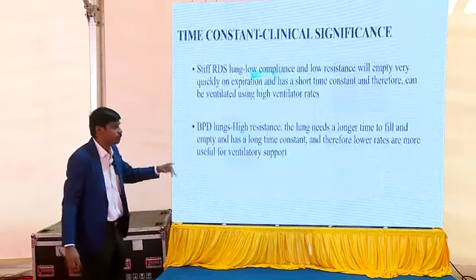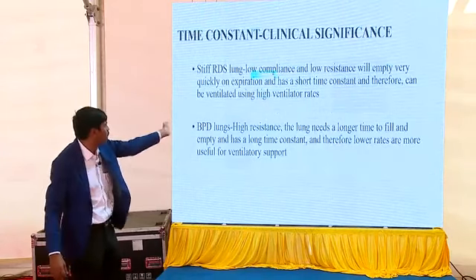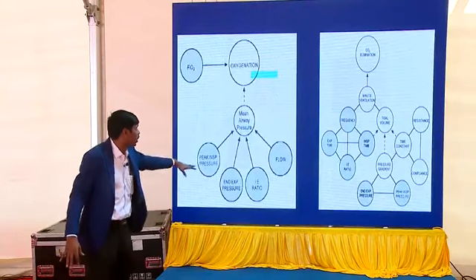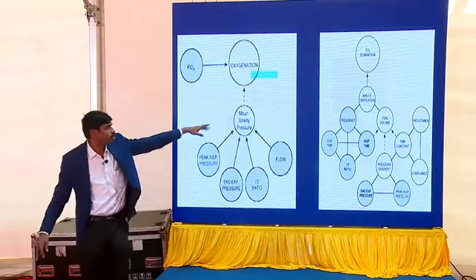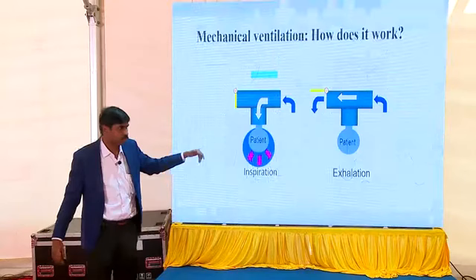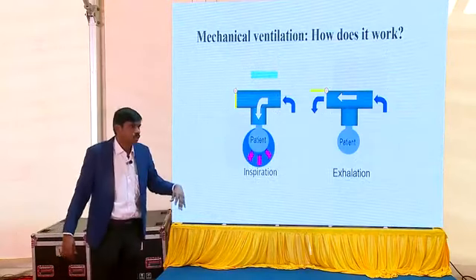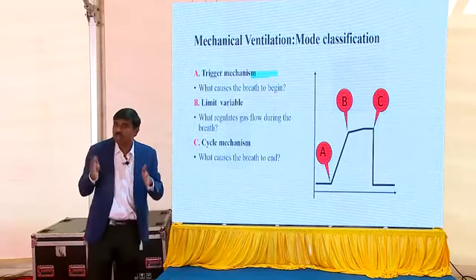Next one. Stiff lung, RDS, will be low compliance. So that's the crux of the entire mean airway pressure, and elimination goes with the minute ventilation, frequency, and tidal volume. I'll rush through, but we again have the same thing through the sessions also.